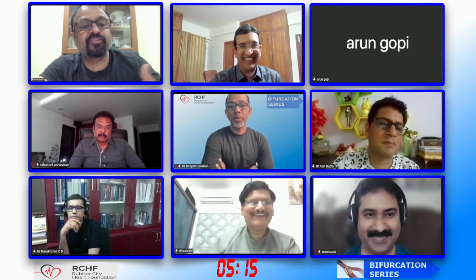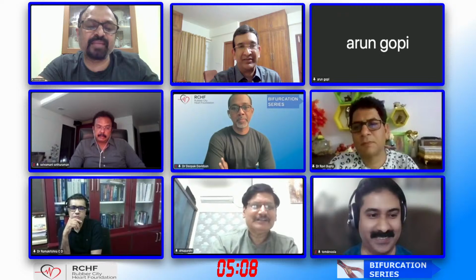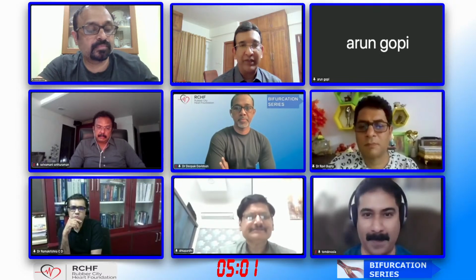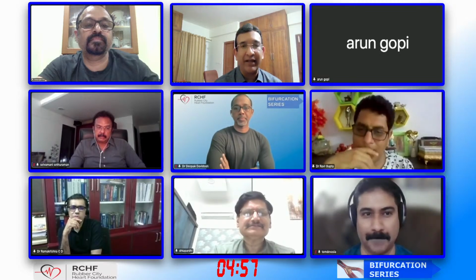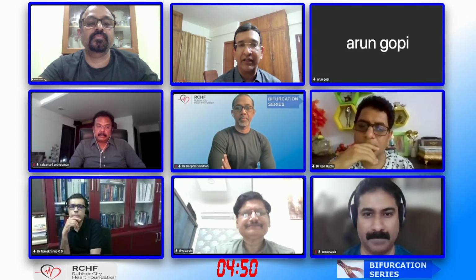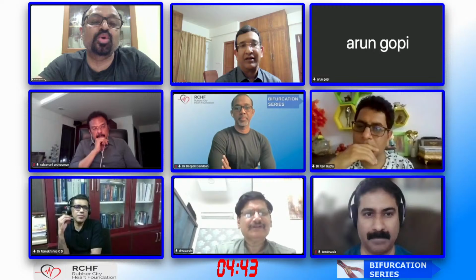If you look at the statistics, it's around 99%. It's not 100%. I would say that the same applies even to the mini crush technique. I think, Natarajan, this is what I asked Dr. Stankovic here. The inverse crush, internal crush and the mini crush are essentially the same, because they have taken it off from the EBC because, they said, in a few anecdotal cases there have been increased incidence of stent thrombosis and deaths. What did you mean by inverted crush when you asked that question to Stankovic, Madhu?